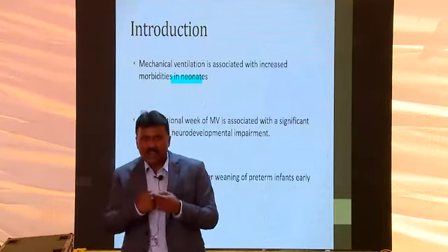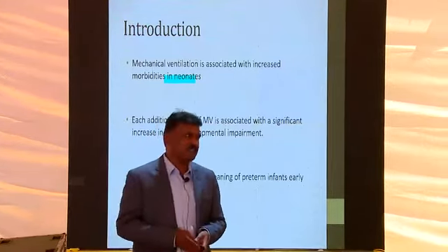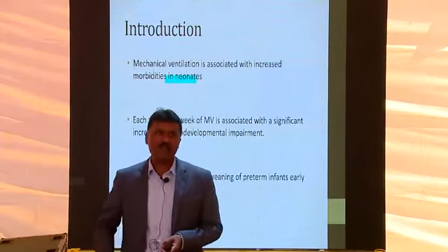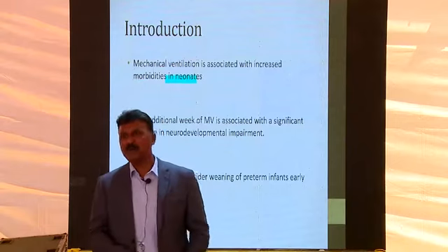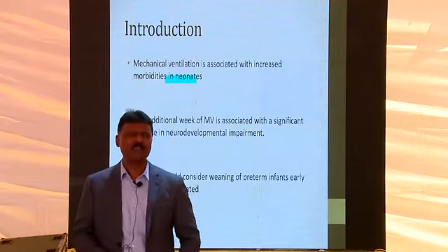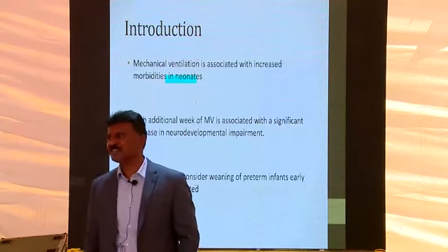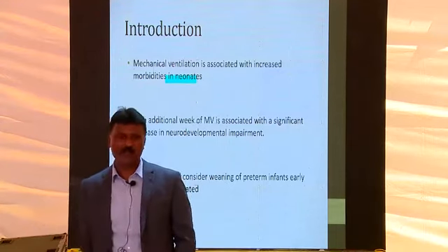You should consider weaning from the moment you intubate. If at 9 o'clock or 10 o'clock I have intubated, and somebody asks me when weaning should start, at 10 o'clock, 1 minute, my plan of weaning should start. You can't wait and say, okay, I have ventilated today and tomorrow I come back. What is the plan? Let us see, he's doing fine. Let me see. Oh, today I'm going, we'll come back and wean on Monday.